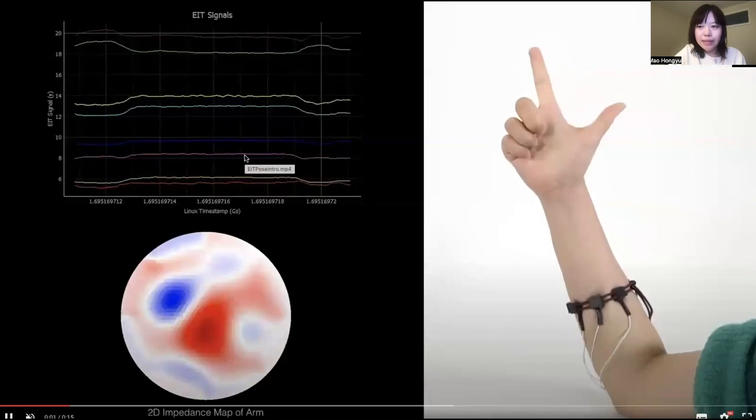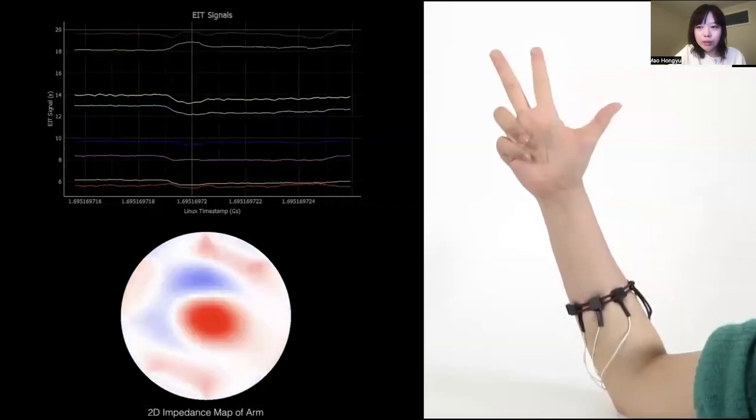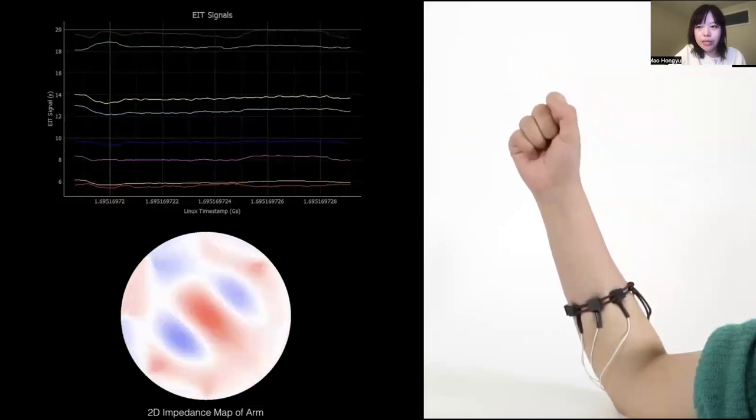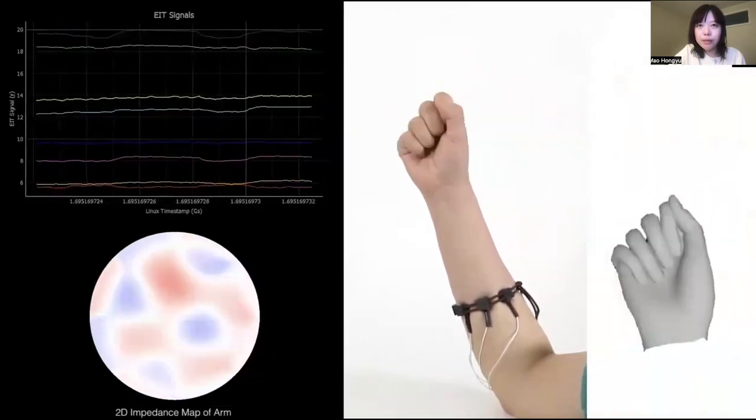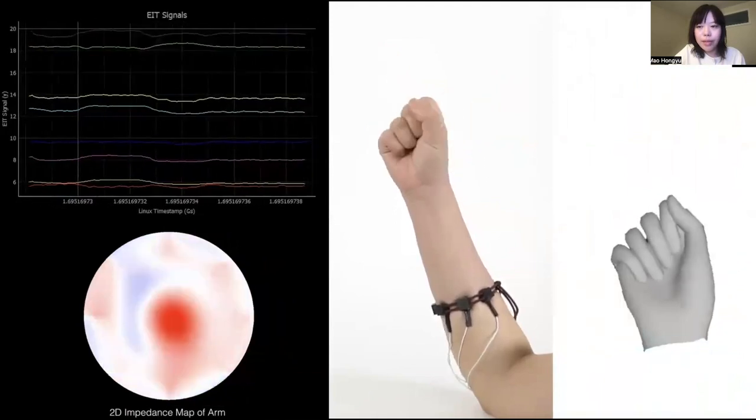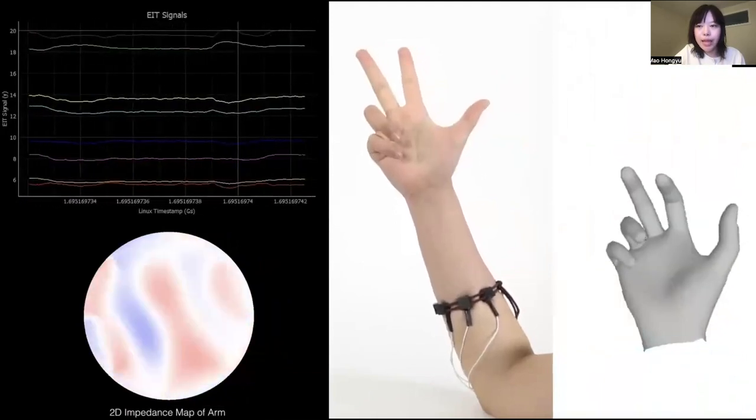To this end, we propose EITPose, a wrist-worn device using electrical impedance tomography to model the impedance distribution of user's forearm and continuously estimate 3D hand pose.